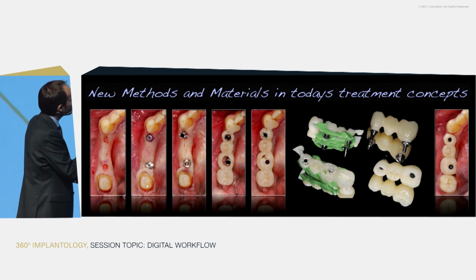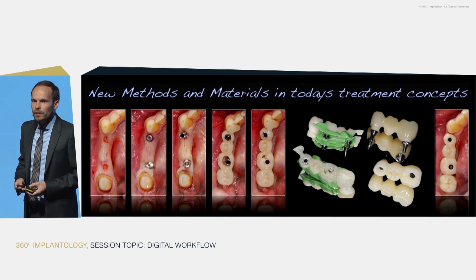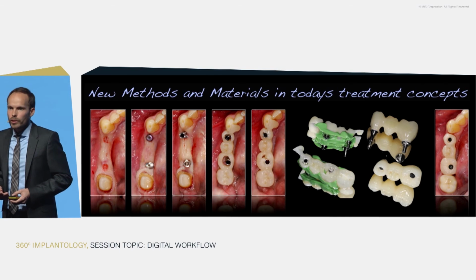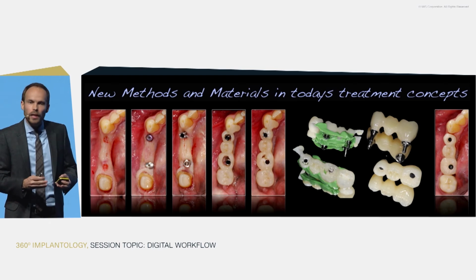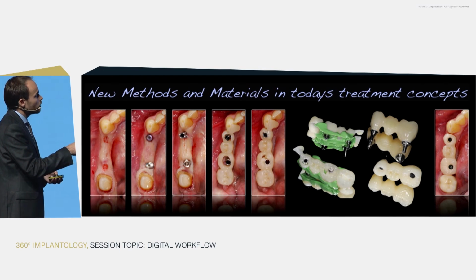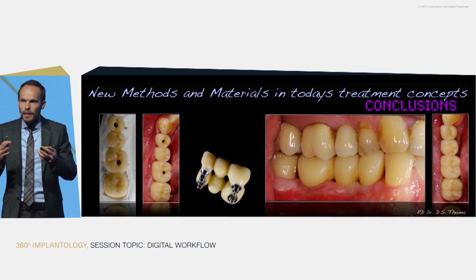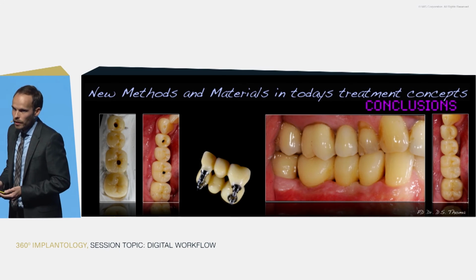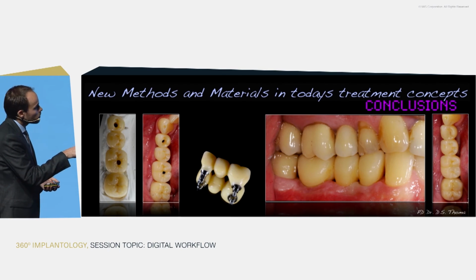We do the abutment connection, we place the same titanium cylinders, and we just reline our reconstructions. So without having any new impressions, we are able to have an implant-borne provisional, as you can see here. And finally, we recreate the same kind of setup for our final reconstruction. So this is completely zirconia monolithic, as you can also see later on.